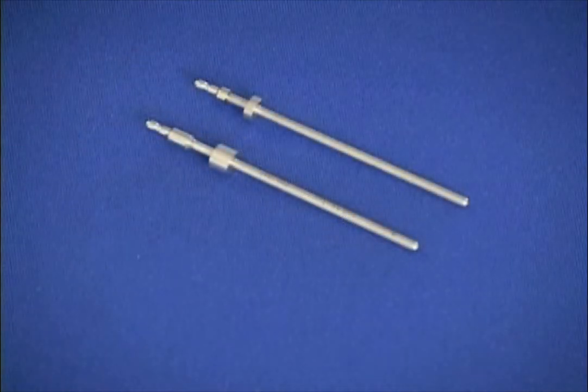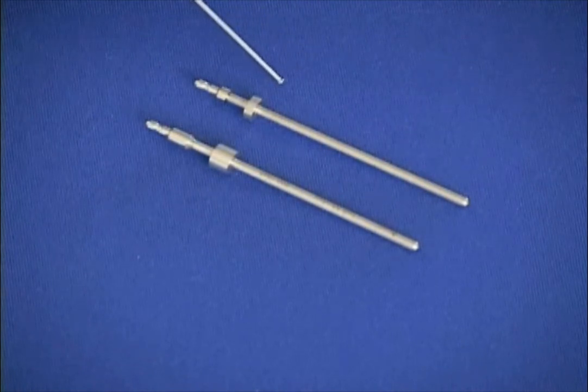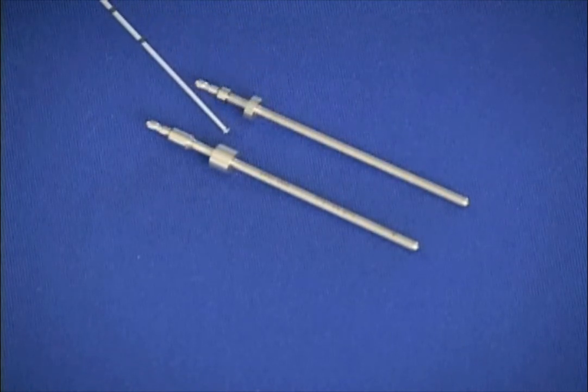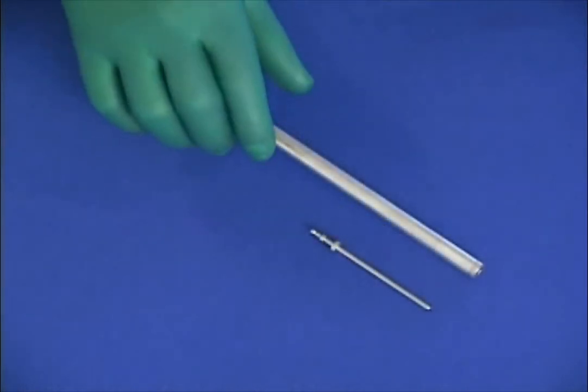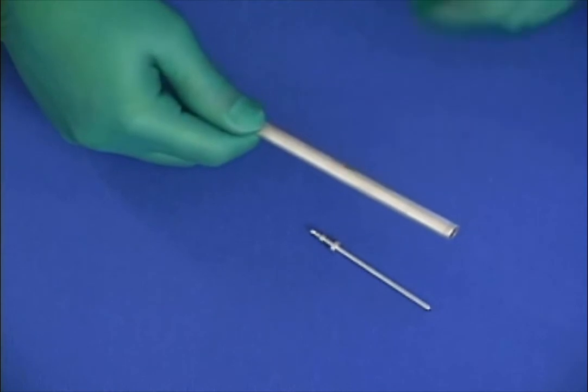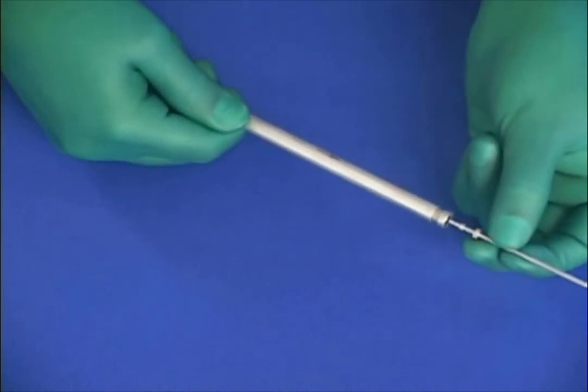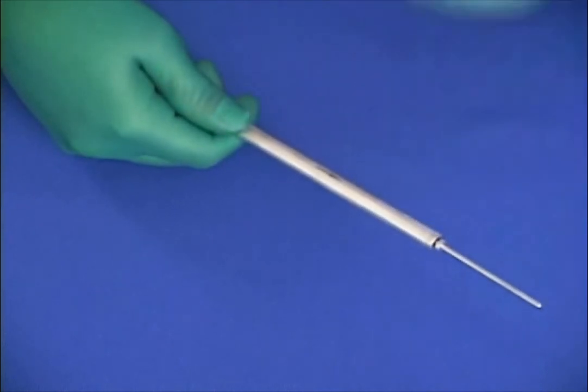Pedicle markers are supplied to confirm trajectory. For clear differentiation, markers are supplied in both left and right configurations. Pedicle markers are loaded into and released from the torque screwdriver by pulling back on the outer shaft of the driver. Releasing the outer shaft of the driver locks the marker into the instrument for insertion.